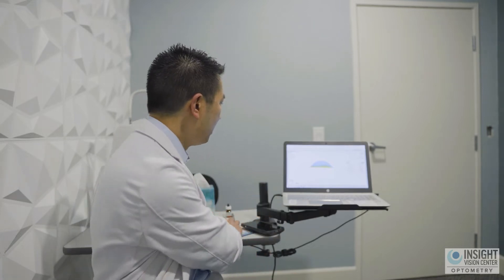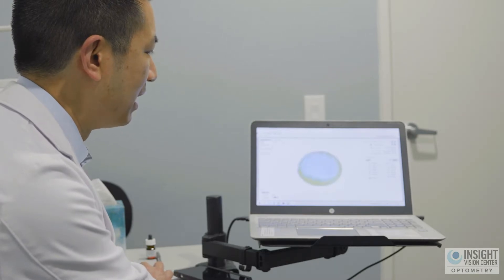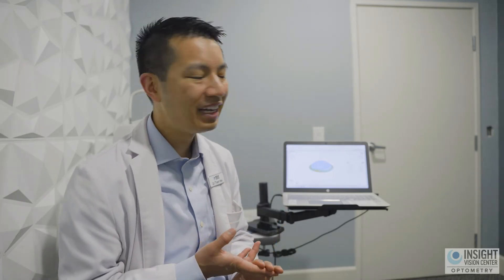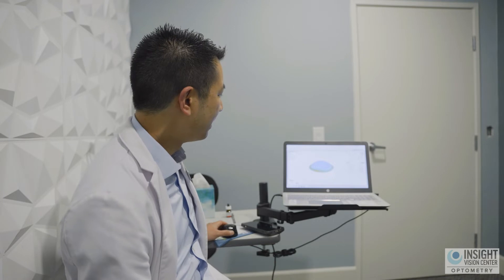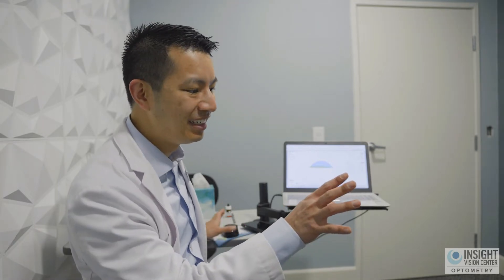We take that image and map out what the best contact lens might look like based on the height of your cornea and the shape of the white part of the eye. The software can design a lens that matches your eye one-to-one. We've essentially scanned your eye, uploaded it digitally, and now we can design a lens to match perfectly. That is step one.